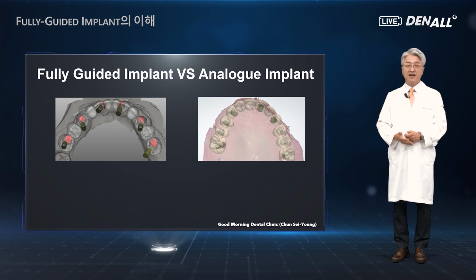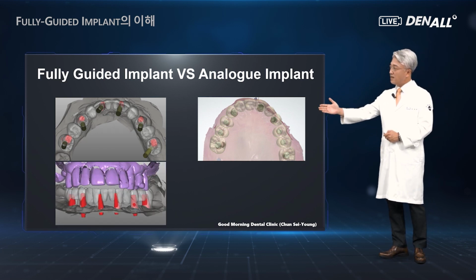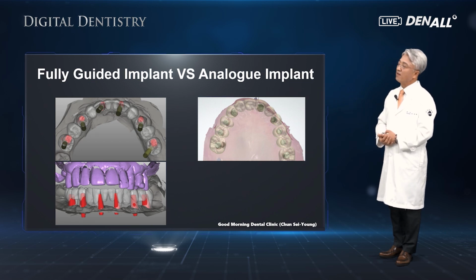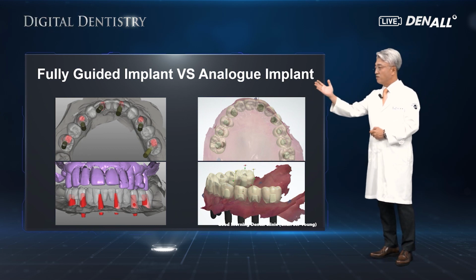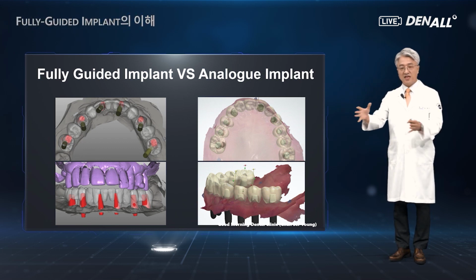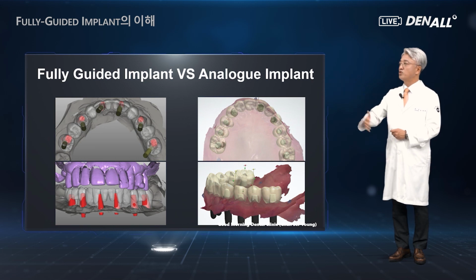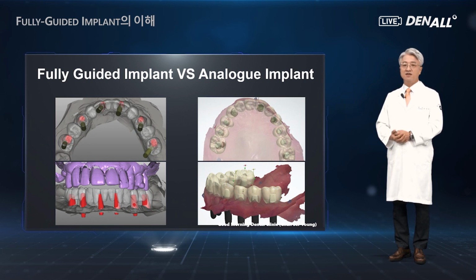In the anterior region, abutments are placed between teeth, and there were difficulties in the lab work to overcome that problem. But using the Implant Studio, in advance, using the top-down approach, the design and the fixture positions are designed, then the problem can be minimized. More aesthetic and natural tooth-like appearance can be achieved, and the relation between the prosthesis and gingiva looks very natural.